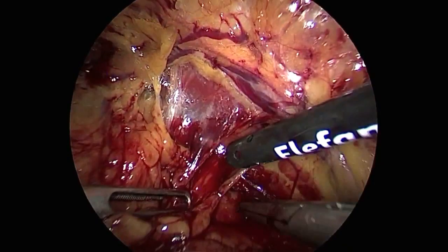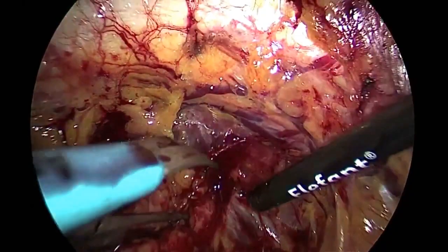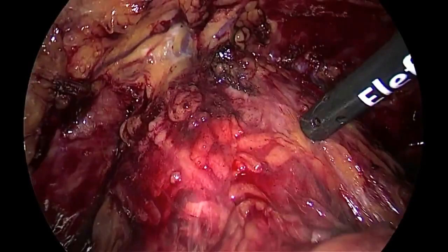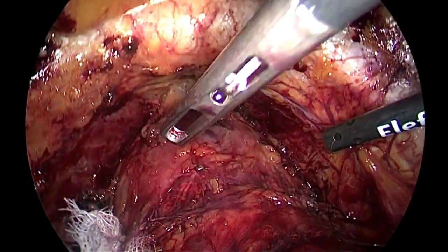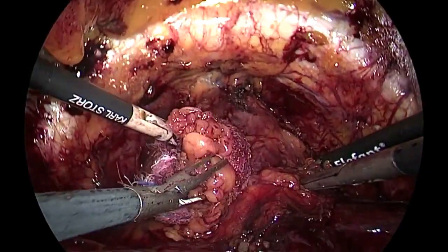Can you enlarge the images, please? Coagulate. Stop. Coagulation. Okay. Down, up, up, up, up. Coagulation, please. Bipolar. Okay.